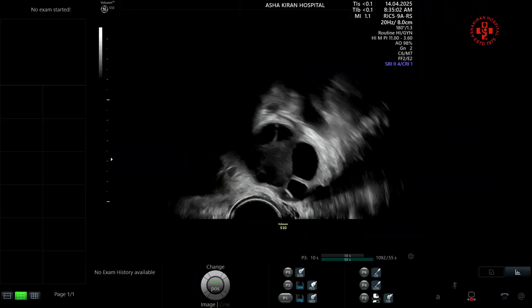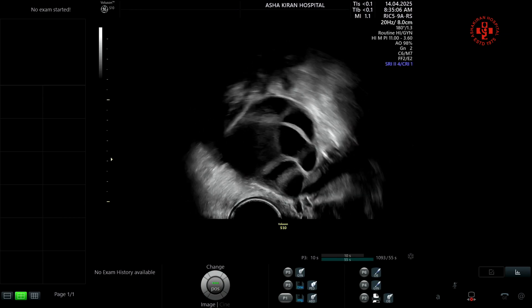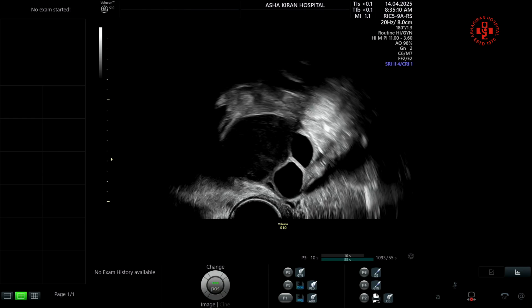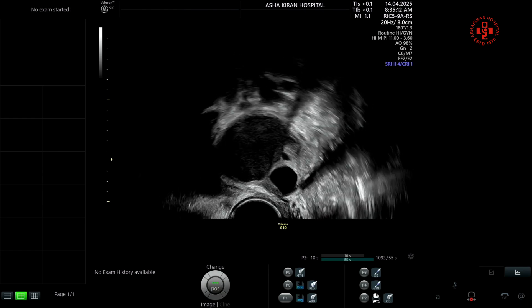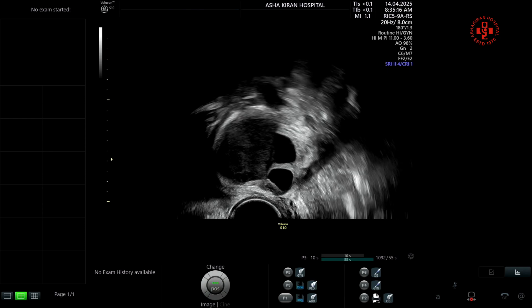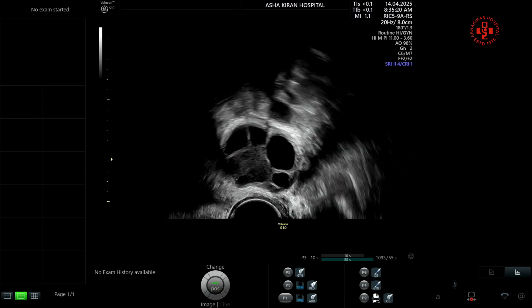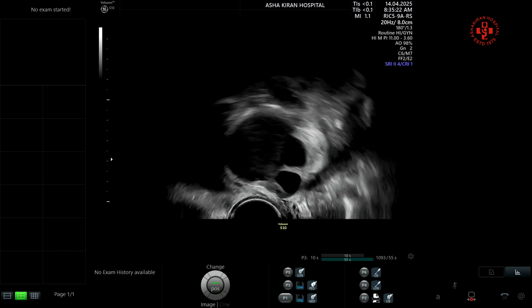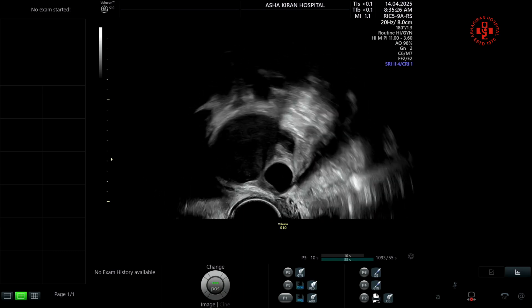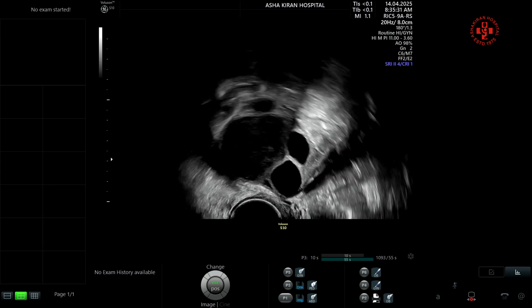Hello everyone. This is the patient in whom we are going to demonstrate our own technique called the brush technique, while doing the oocyte pickup in an endometriosis patient. All of us know that with endometriosis, there are two options: whether you should operate the patient first, or do the oocyte pickup, cryopreserve the embryos, and then proceed with the endometriotic surgery. This patient has traveled from the USA to us.